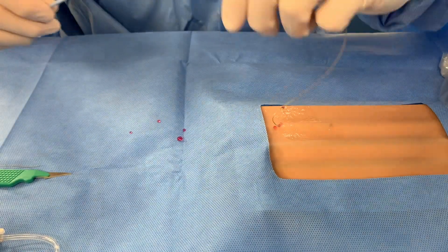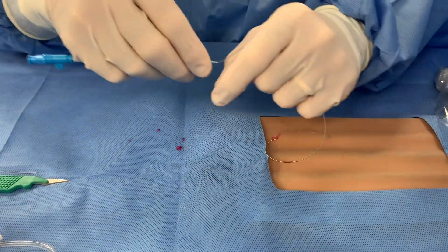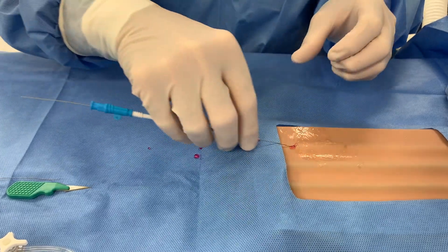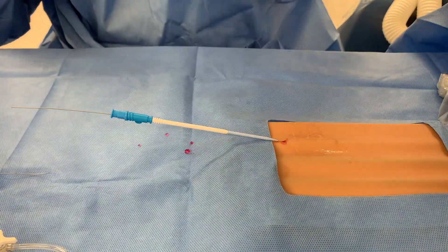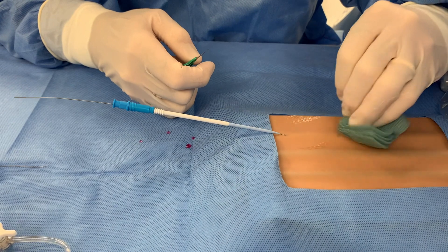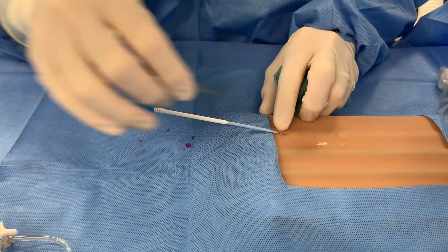Load the RIC sheath and coaxial dilator onto the guide wire, ensuring that the guide wire exits the catheter hub. Make a 2-3mm superficial skin nick with an 11 blade scalpel.